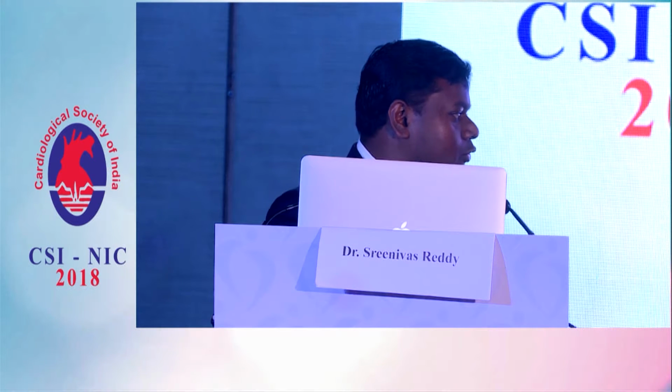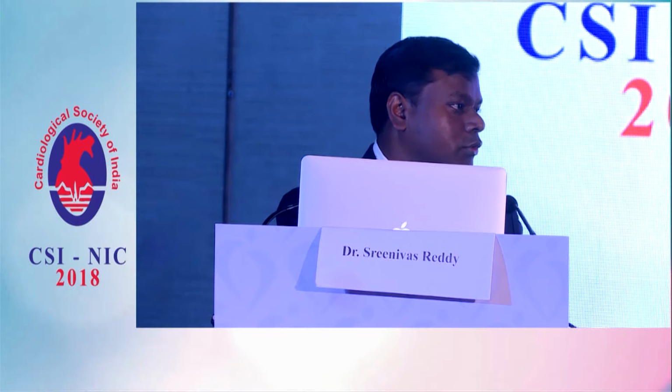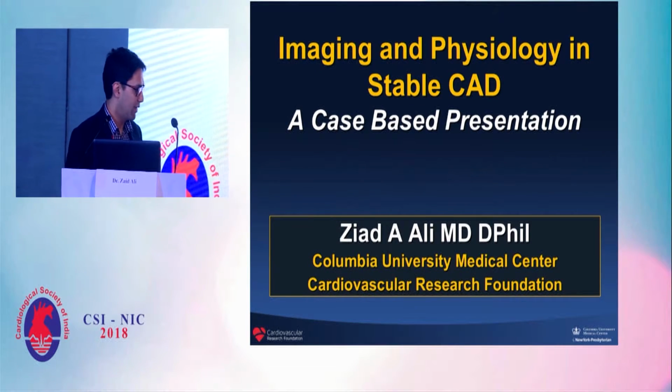But I think you should use whatever imaging is available. For OCT, we should understand that we need a clear field, we need to clear the blood. Especially in ostial lesions and the left main, you will not be able to clear the dye, or if the vessel is more than 4 mm, you will not be able to do good imaging with OCT. But now, coming with pressure injectors, Dextran and all, we are still able to get good imaging even with OCT. But with IVUS, we need not use any dye, just put in a catheter, wait, and you get very good imaging. So it's not which imaging is better, but we should use whatever imaging is available at the time. Okay, thank you very much, moderators.